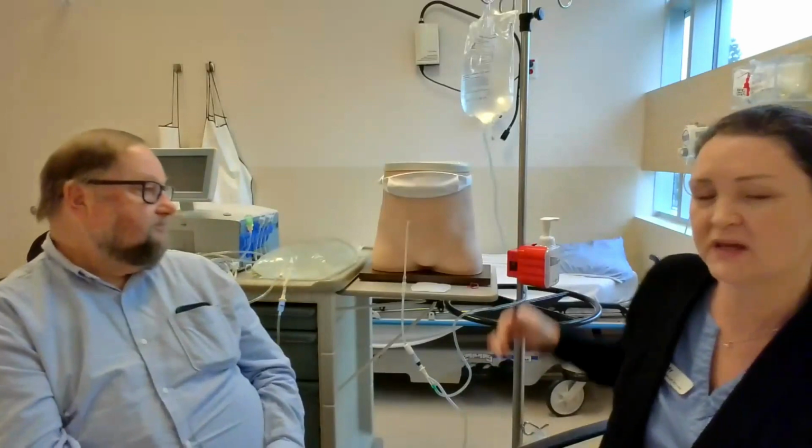How are we typically managing it? Definitely, it can be serious if we don't treat it right away. Once you have the catheter in and you've started doing your exchanges, we get you to monitor the drainage. If it is cloudy or if you're having abdominal pain, you would call us right away. We want to get you on antibiotics.